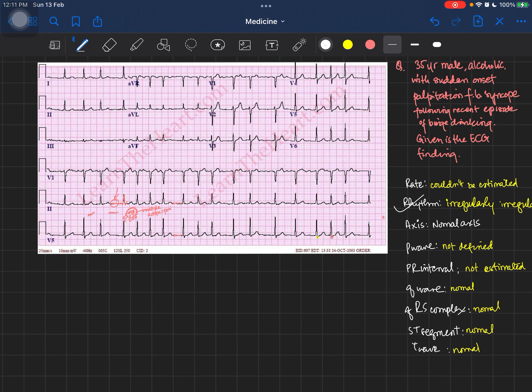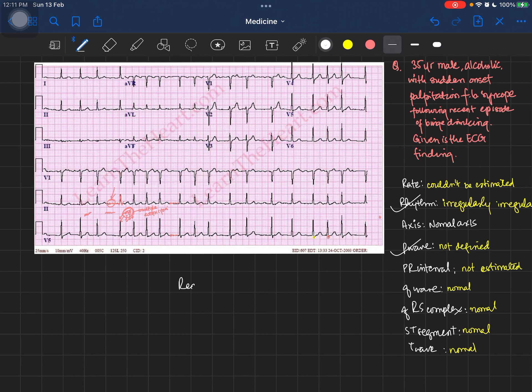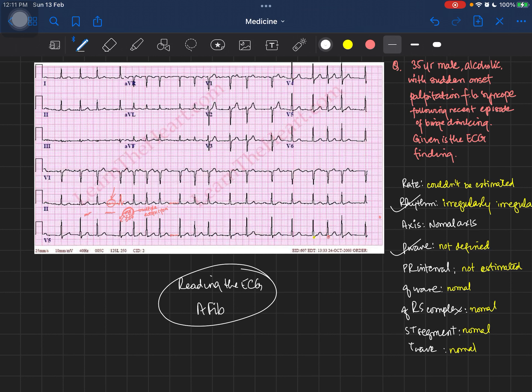So what are the characteristic findings of an atrial fibrillation ECG? First, an irregularly irregular rhythm. Second, a normal axis. Third, the P wave is absent — not defined — with squiggly lines in its place. This is how you read the ECG of a patient with atrial fibrillation.